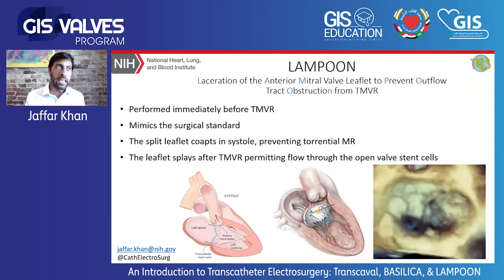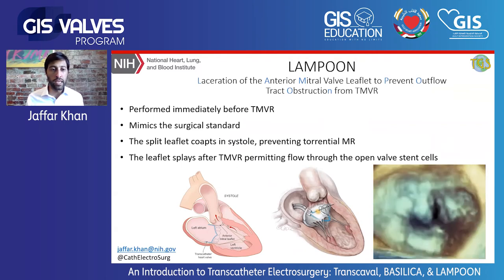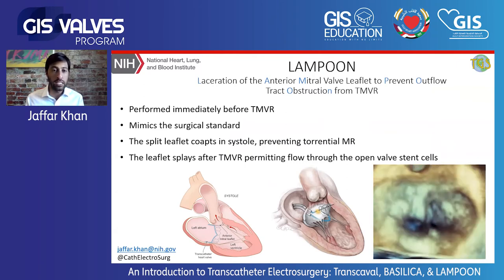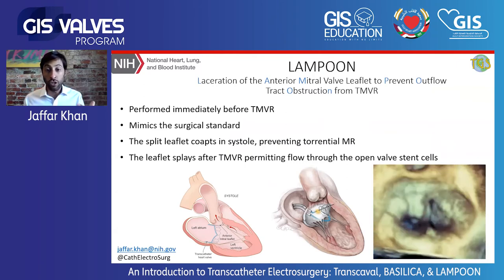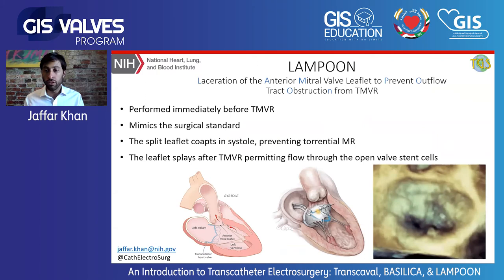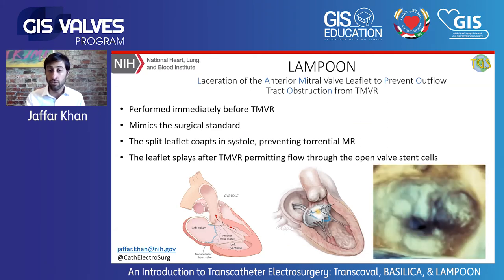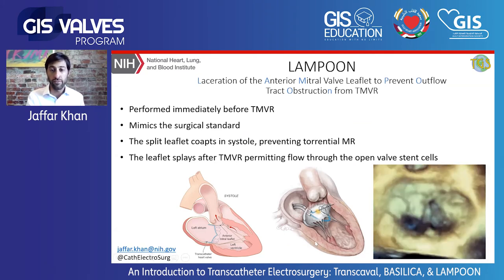Now, in TMVR, LVOT obstruction is a major problem. It affects up to 50% of all cases. It again has a high mortality, and it is a major cause for screen failure for all the new transcatheter mitral valve replacement devices. The LAMPOON is a procedure that mimics the surgical standard, which is resection of the anterior mitral leaflet and preservation of the cords.